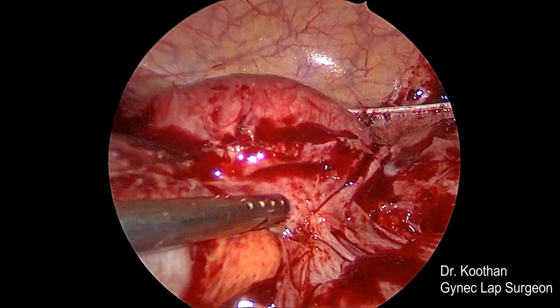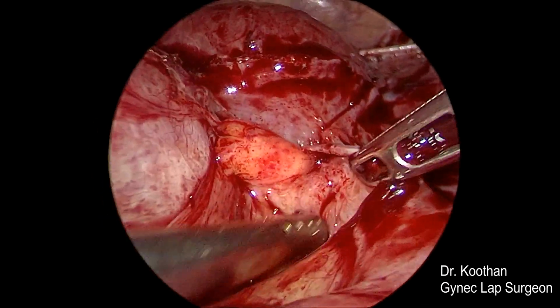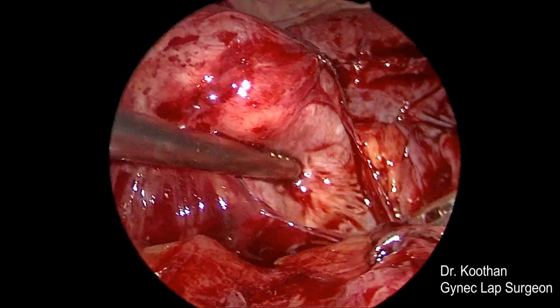What you are seeing is the mesorectum, which is completely plastered to the Pyosalpinx. We are lateralizing the mesorectum. We are medializing the mesorectum completely from the Hydrosalpinx.